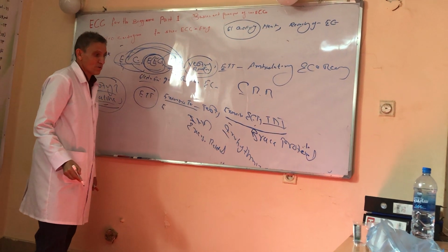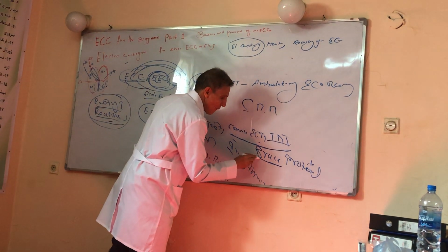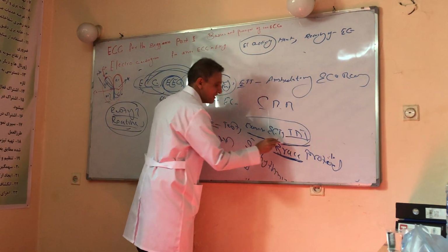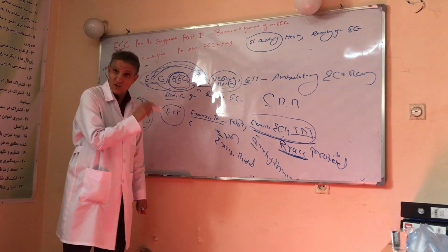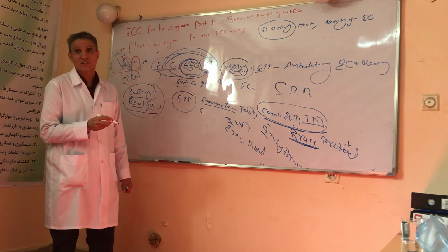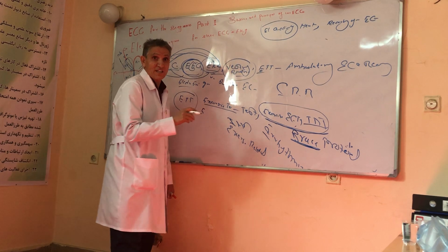Bruce protocol or modified Bruce protocol. We will have a detailed discussion about the ETT in my future lecture. Right now, we just take the name of this test. This is also ECG, but it is not simple ECG. This is a little bit complicated. During performing this test, we should be cautious about some critical conditions which may occur.